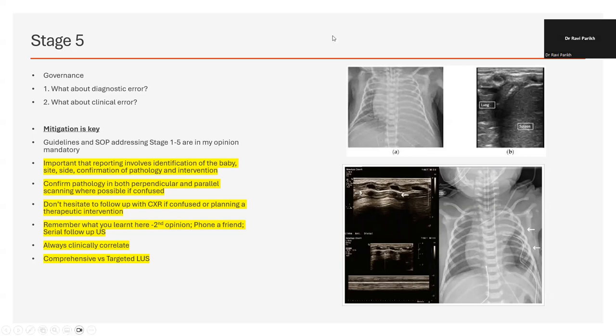So I would say that you can actually do all of the scans for the anterior lateral regions within literally 60 seconds with your M mode. You can review those images afterwards, but yeah, I would say that best practice is that you do the M mode for all regions. I wouldn't necessarily say that you go into each transverse space and start doing M mode. I think if you've confirmed that for a longitudinal area by putting your M mode in the entire region, that's good enough. Does that help? Thanks, Alok.